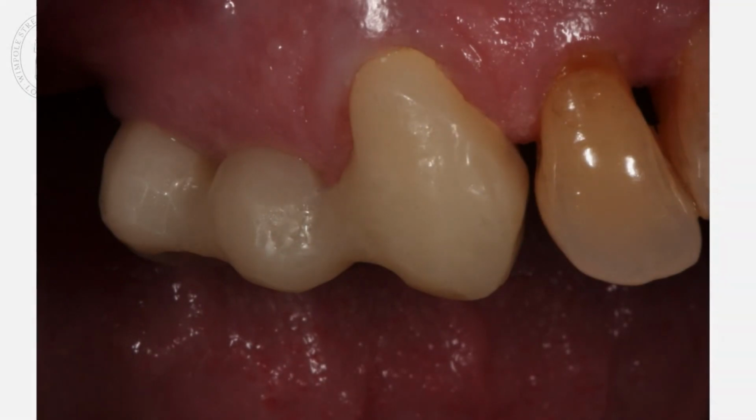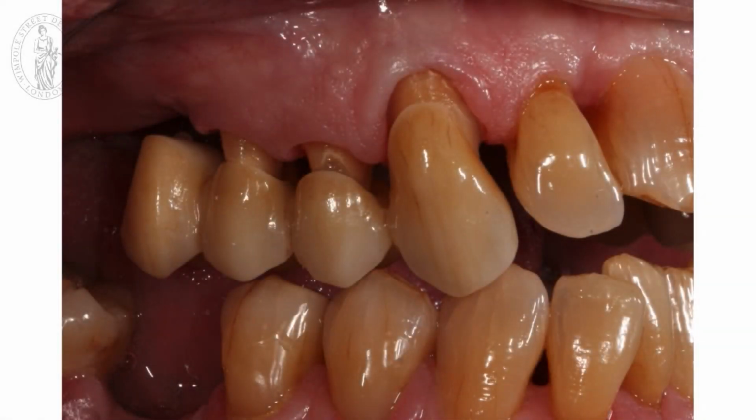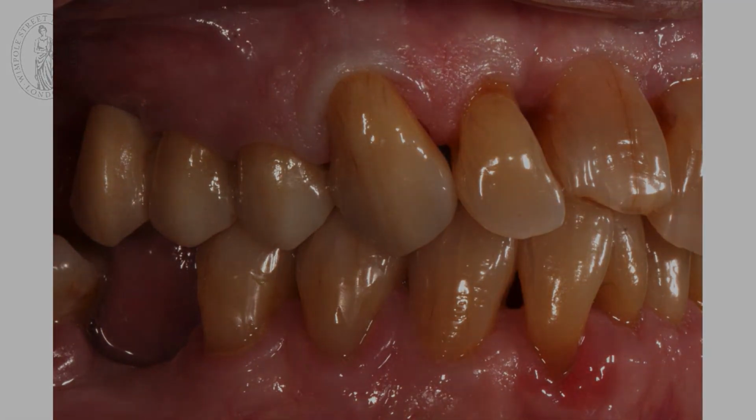This is the temporary. These are the prepared teeth underneath. And this is the bridge, and you can see already now, color-wise, this bridge is going to fit absolutely perfectly. So, wonderful case from the dental technician, and you can see all the effort we put into color taking really paid off. And then you can see the bridge in place, bite perfect, color perfect, nothing to complain about. Let's go and cement it.